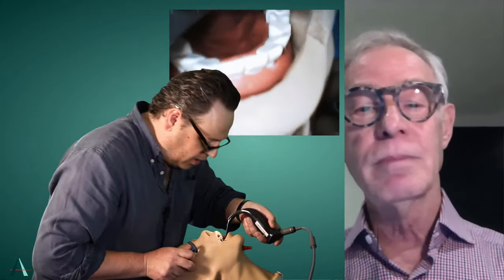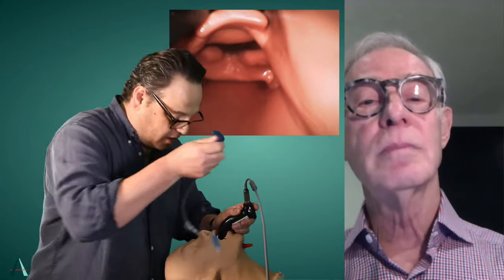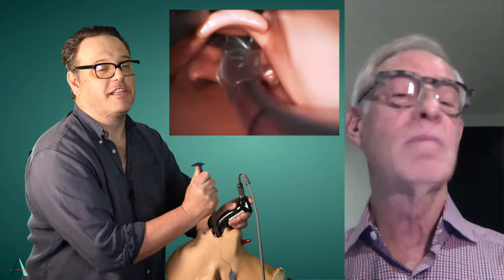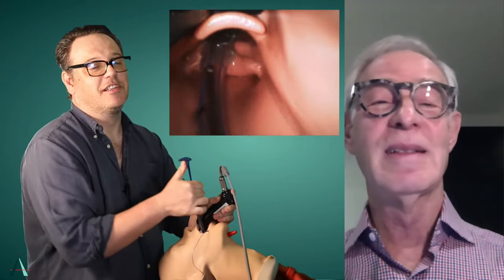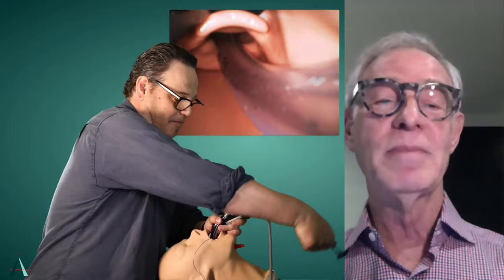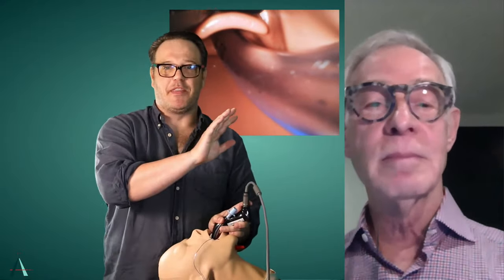So it's look in the mouth, look at the screen, look in the mouth, look at the screen, exactly. Position, lift, tilt, perfect. Shuffle. And I get a bit of hang up here, which is really mannequin hang up. Plastic on plastic. Beautiful.